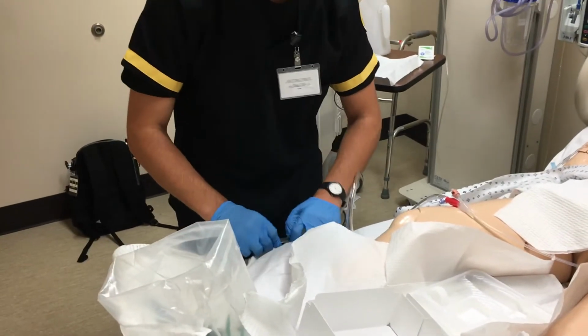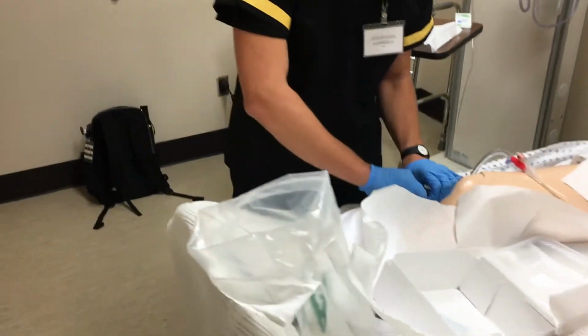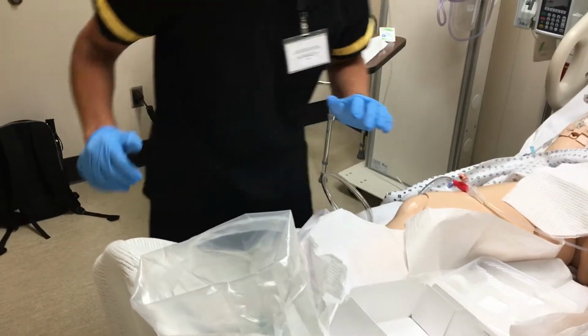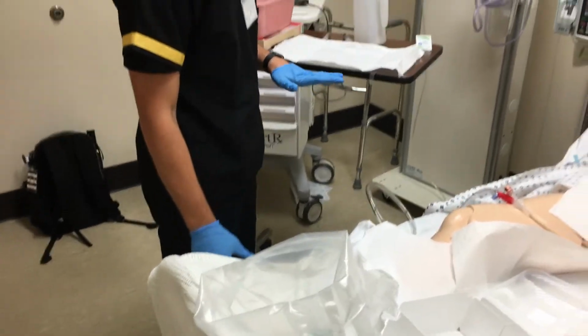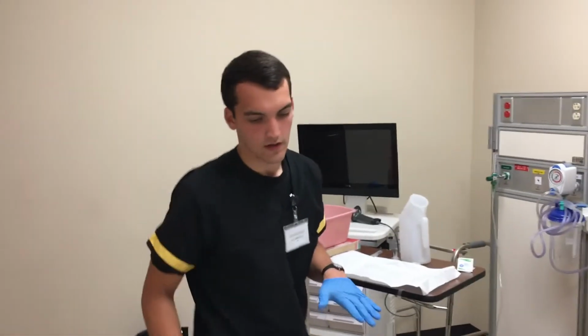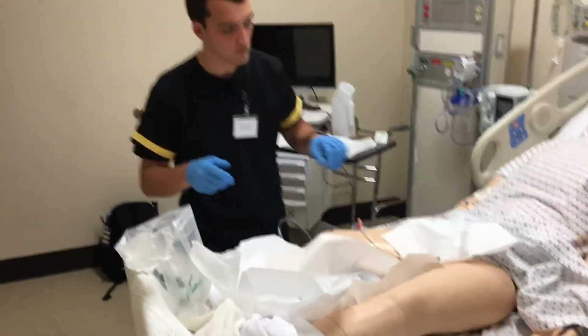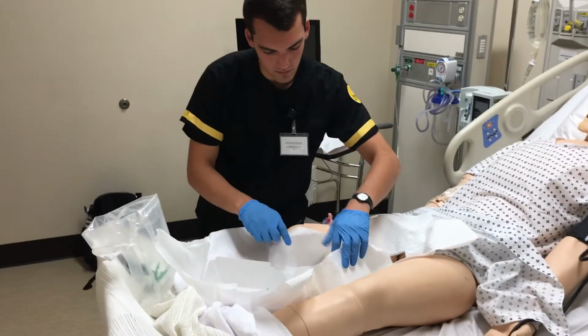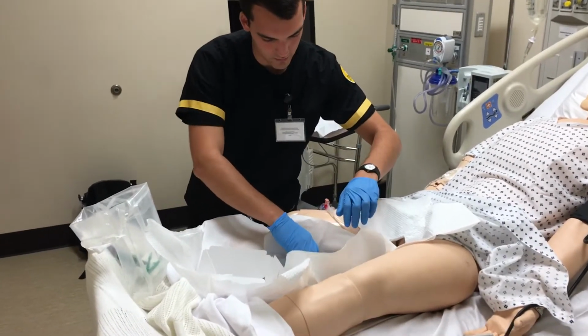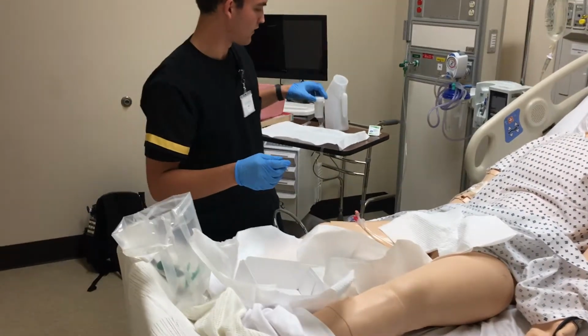Okay. There's your loop. Now, I'm getting good flow rate on this urine. It's light yellow, and I'm going to go ahead and clean up my field. But first, I need to take a sample.